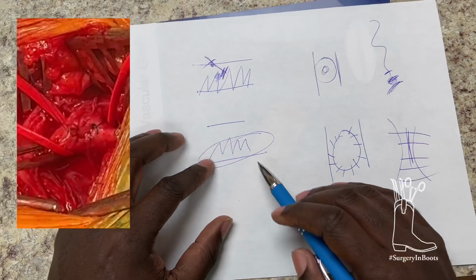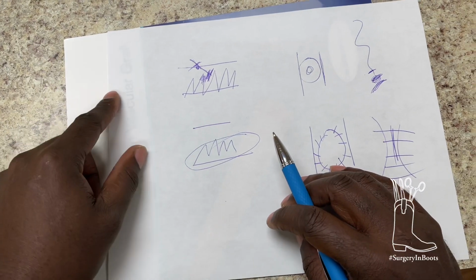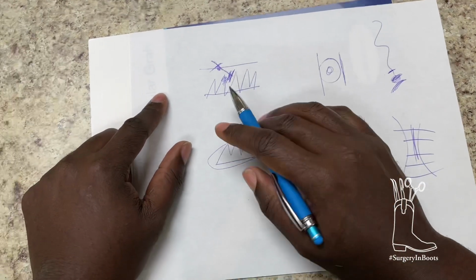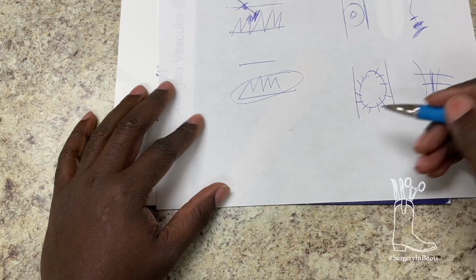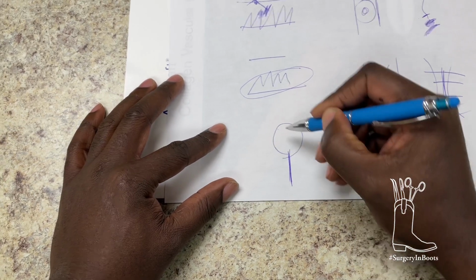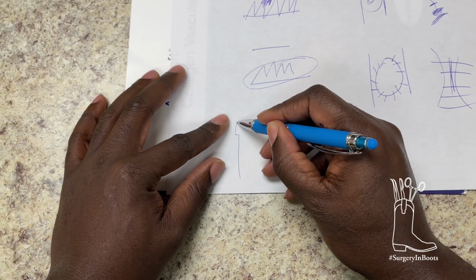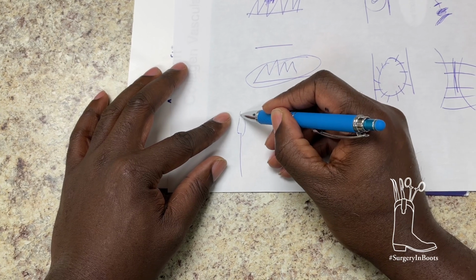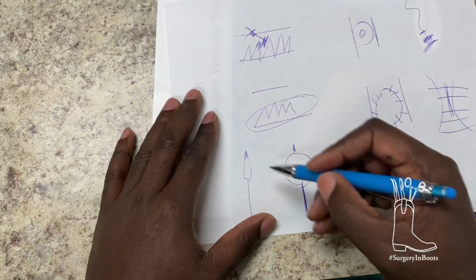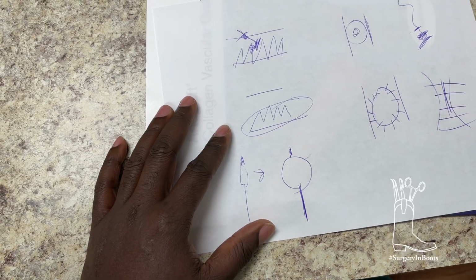Now, if your heart's up here and your leg's down here, once you block this off, clot forms all the way back up here. So you go back in with what we call Fogarty catheters, basically a catheter with a balloon. When it's down, it looks like this. When you blow it up, it's like this. You push it down, get above the clot, blow it up, and then pull the clot out. So that's what we did.